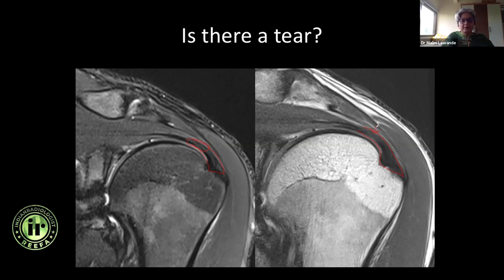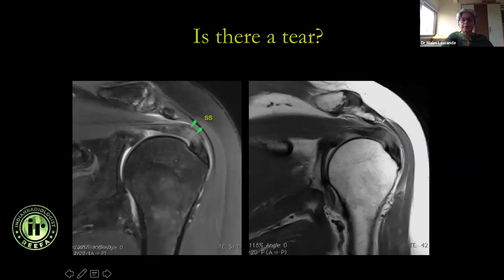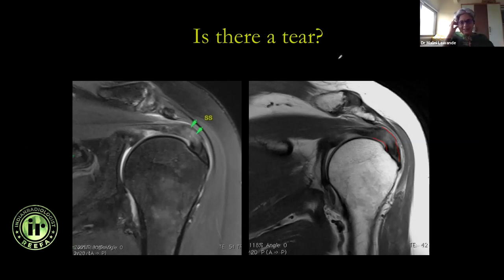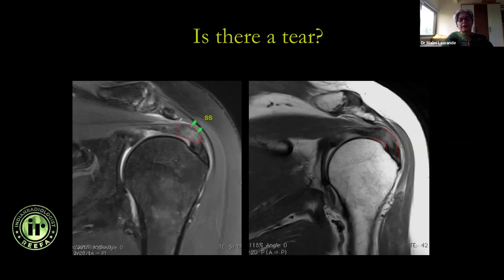If I call it minimal or mild critical zone tendinosis, nothing changes — it's not something that's going to need surgical management. Now this tendon looks abnormal for sure: it is thickened significantly and showing bright signal, it's no longer dark. But is it a tear? No, it's tendinosis. The correct term is tendinosis or tendinopathy — we do not use tendinitis because there is no inflammation. You want to say whether it is mild, moderate, severe, or advanced — here there is advanced critical zone supraspinatus tendinosis.